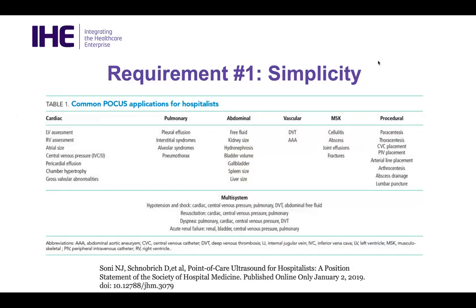And this is from a paper that came out in the Society for Hospital Medicine. Just some examples of some of the typical types of procedures that are done in a point of care ultrasound setting. It becomes really hard to bucket all of these into anatomy or other things like that. So using the encounter-based imaging workflow profile in a deployed out systematic way becomes valuable for the hospitalists, ED providers, surgeons who are trying to quickly capture metadata on the data that they are gathering.